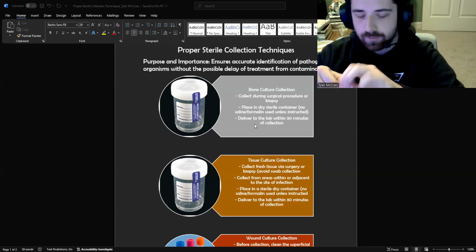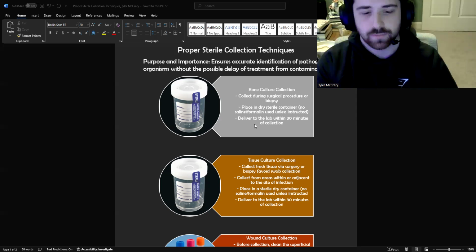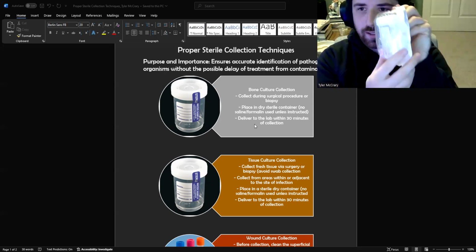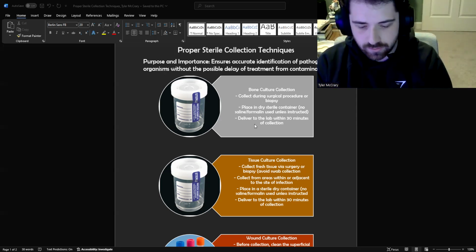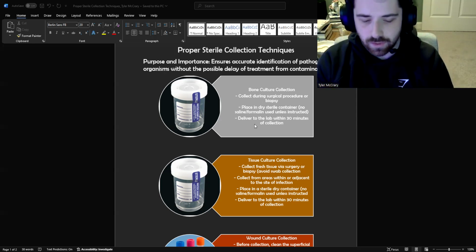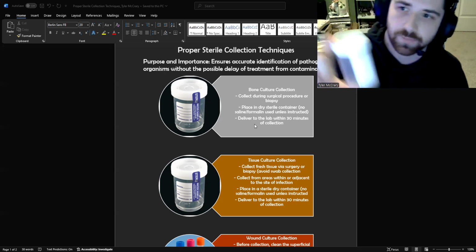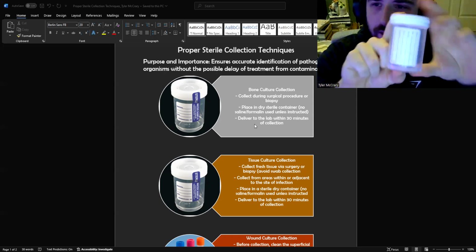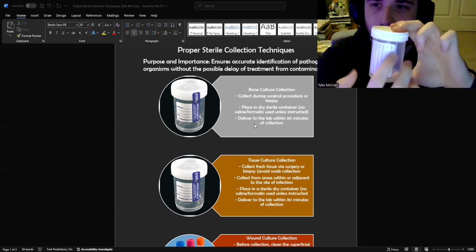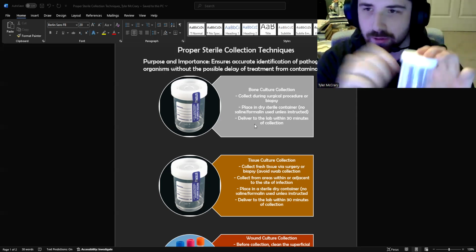Let me open it real quick. So obviously this is a sterile dry container. That's why it's in this bag, to keep it sterile. This is kind of like what I have listed in the picture on the pamphlet. It's just a sterile, dry container. It has a place where you can label it. We have patient labels that we print out, so we don't write anything on them.